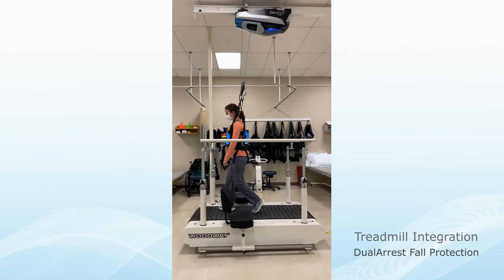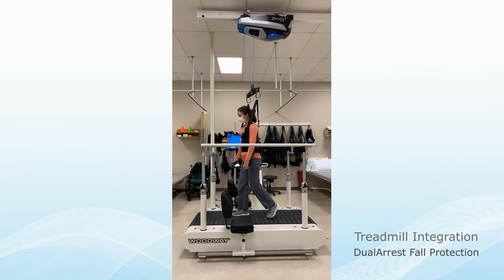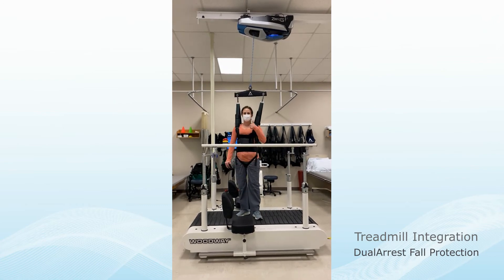And with dual-arrest fall protection, if the subject were to fall, Zero-G prevents the fall while simultaneously stopping the treadmill.